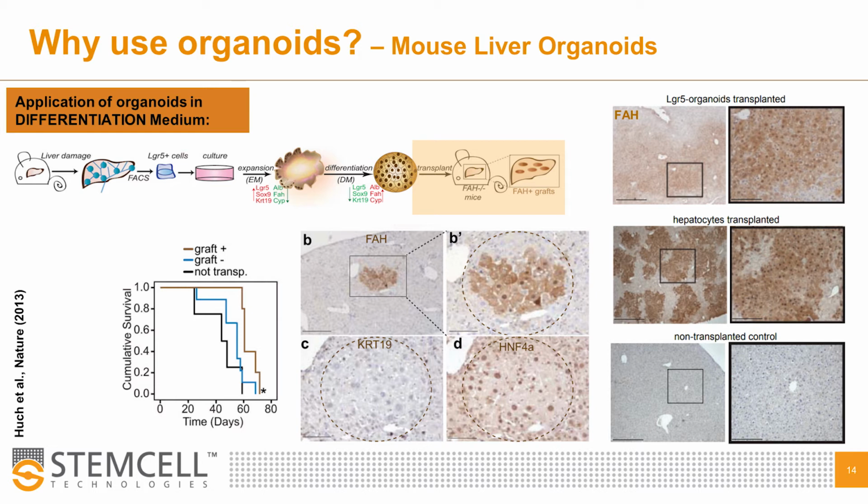As a proof of concept study, this publication created a lot of excitement in the research community and led to the question about possible implications for studying the human liver in health and disease. Since human tissue is significantly harder to come by than primary mouse tissue, the value of a human liver organoid system is even greater. It would lessen or even remove the restriction of liver biopsy availability and expand the breadth of studies a given lab would be able to perform.